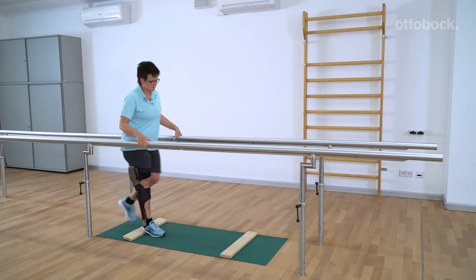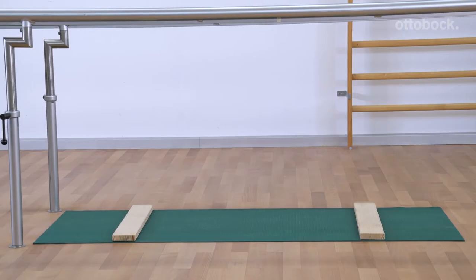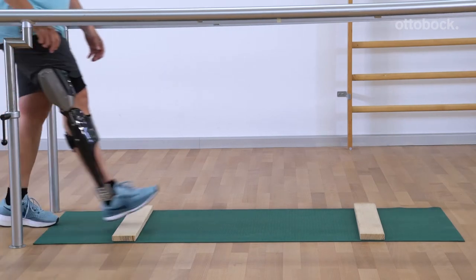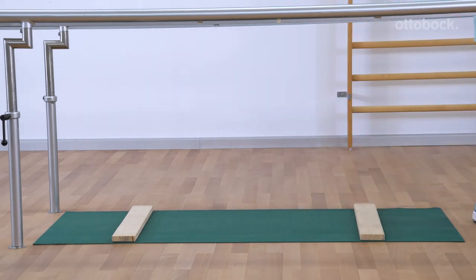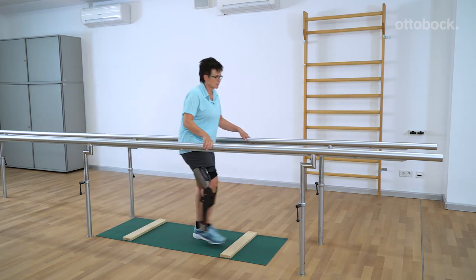When crossing small obstacles, the patient steps on the obstacle with the heel to trigger knee flexion. This helps the sole establish full surface contact more quickly, improving safety in the stance phase. The swing phase is initiated automatically when the patient crosses the obstacle.